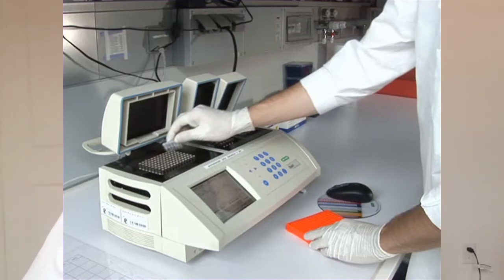So after the extraction, the next step is actually putting the sample through a machine called PCR. A lot of people that have done sciences have used this technology at the university level, at the master's and the PhD level. The PCR is a very complex instrument where it actually can extract this RNA and it does the analysis to tell whether the person is positive or negative.